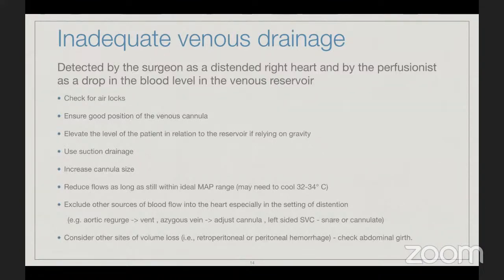And also, can I add something? Sure. Sometimes when you first cannulate selectively with single stage cannulas in the IVC and SVC, you have to unclamp the first and make sure it's draining, and then unclamp the second. Because if you unclamp both at the same time and you have a problem, then you have to look at where exactly the problem is.